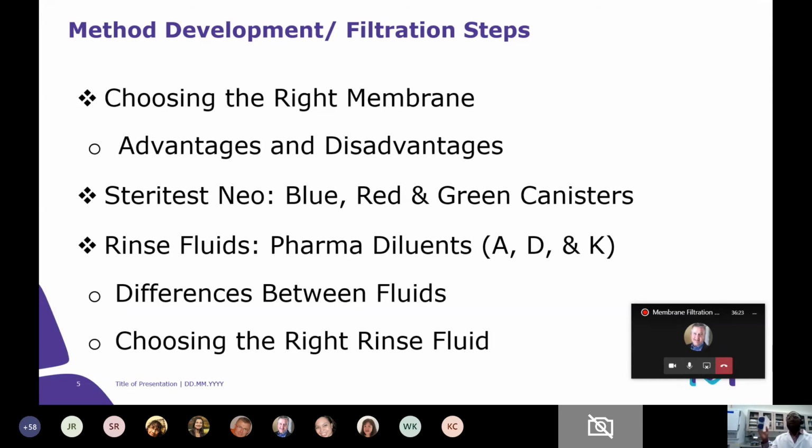For instance, for sterility testing, we have the blue canisters here. These ones I showed you were rapid. We use the Milliflex for the rapid sterility testing. But if you're talking about sterility testing using the Symbio pump, which is behind me here, you would have to use the canisters. And these canisters have the different membranes we already talked about. These blue come with the MCE membrane. So all these regular product buffers and stuff, you would need the blue canister. You would straight away go to these because you will know that they would filter.